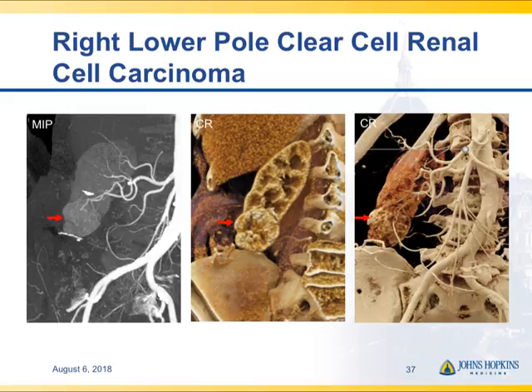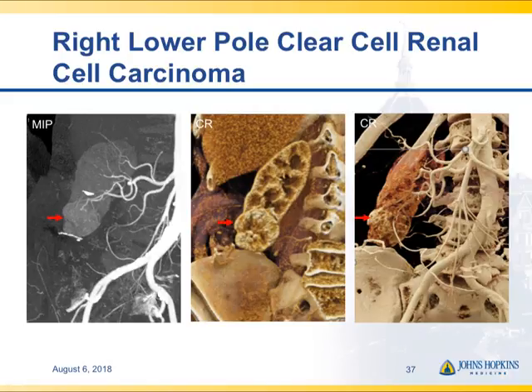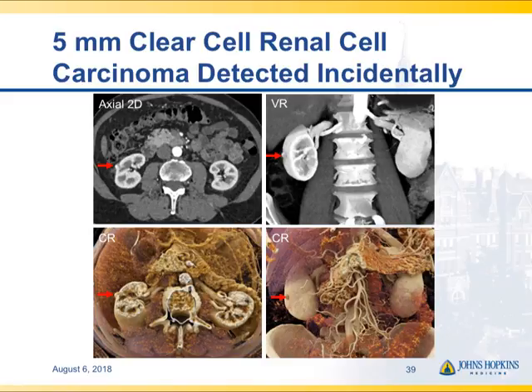Renal cell carcinoma — you can see the textural change in the mass in the lower pole of the kidney. One of the things we're looking at is whether you can distinguish chromophobes from clear cells and papillaries based on texture differences. About 25% of patients who go to surgery for a renal mass have a benign process, and perhaps this will be one way to make that information better. Here with obvious neovascularity, preoperative planning nicely shows the vessels feeding the neovascularity and its extent. We also picked up a 5-millimeter renal lesion — really seen as a dimple on the renal surface on cinematic rendering — which was a small renal cell carcinoma, very easy to walk by but nicely shown.